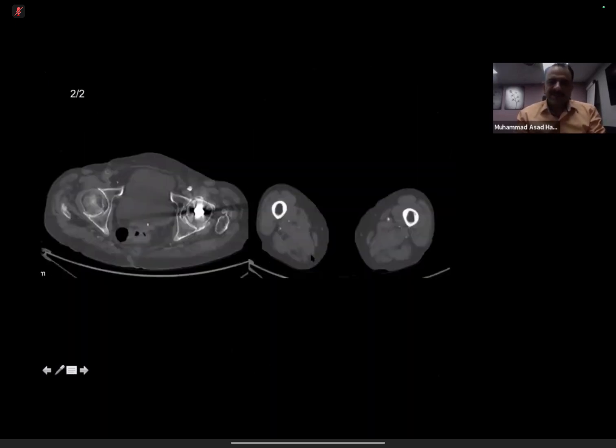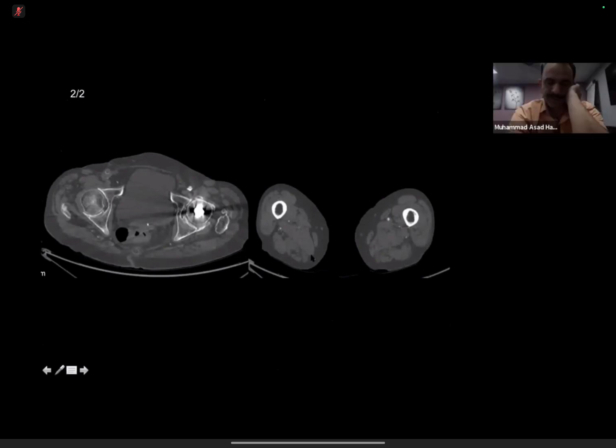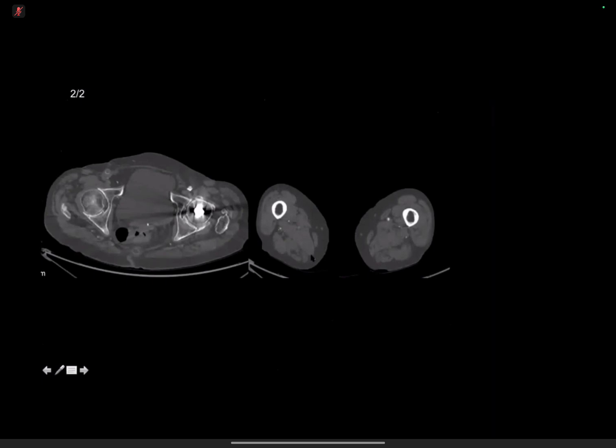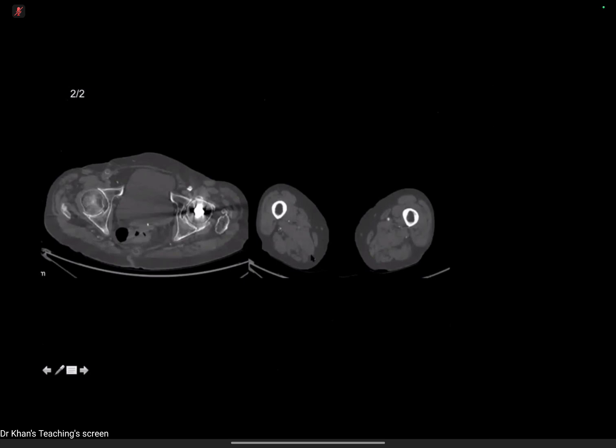And there are the next images. Okay, so what you can see here. I can see total occlusion of the right common femoral artery. Good. And of course the SFA is not filling either. Only some small branches of the laterals, maybe the profunda, is filling in intramuscular branches.